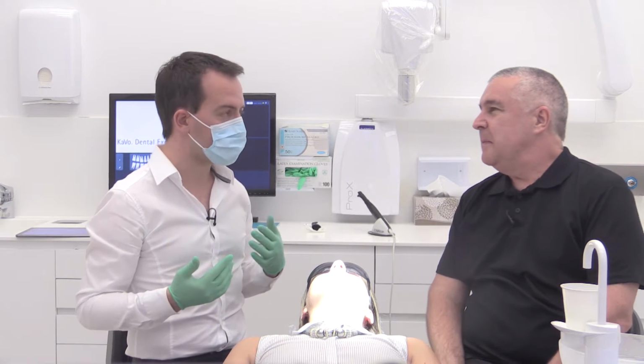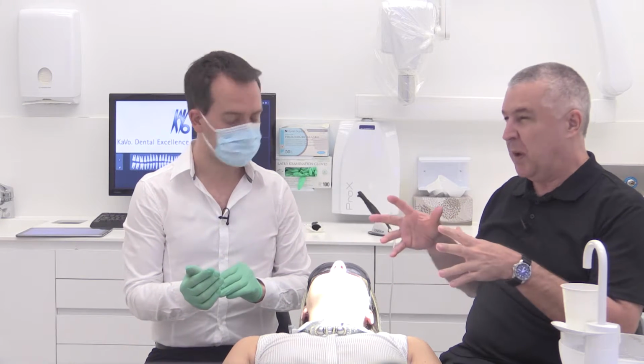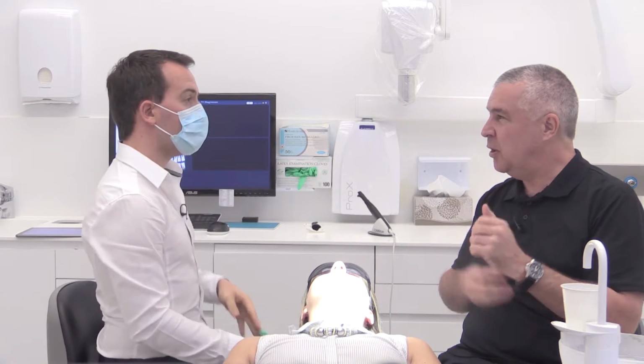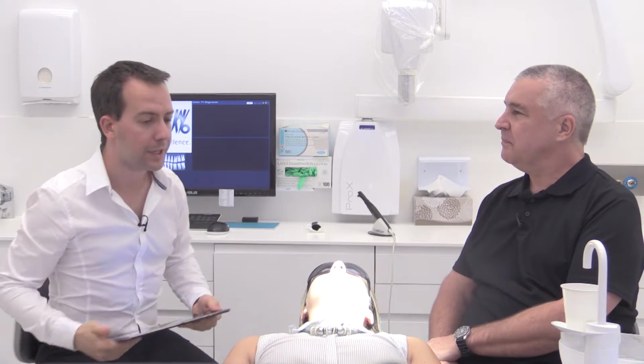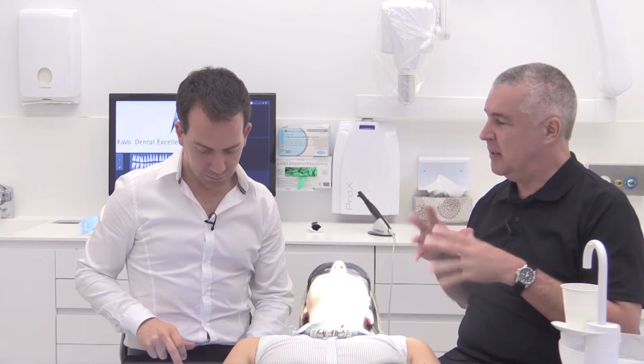And there are two sizes of tips, aren't there? There's a large and a small. That's right. The large one's designed essentially to do your molars, and the small one's designed to do your premolars. And if you're looking at the sides of canines as well. So normally we just switch between those two tips. Although just on Emma we've just used the larger of the two tips. Okay. Yeah. And for use in paediatric dentistry, would you tend to favour the small? Normally the small tip will get you around most teeth. It's really when you run into a lower second molar that you might have wished that you'd actually put the larger tip on. But certainly the small tip will easily fit around a lower or an upper first molar because they're obviously quite long, thin teeth.